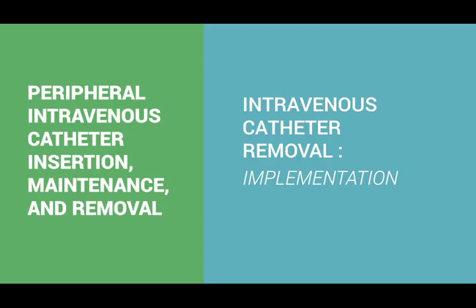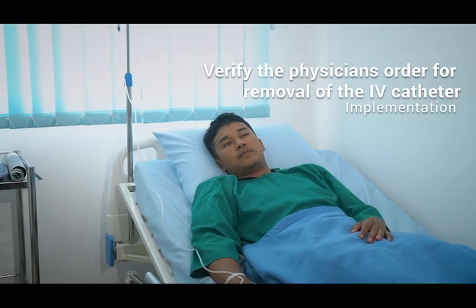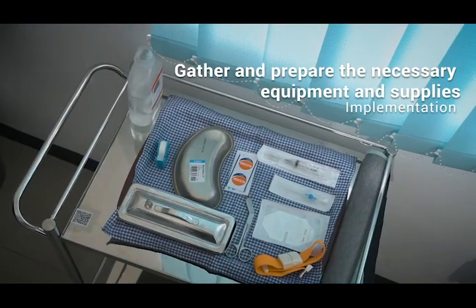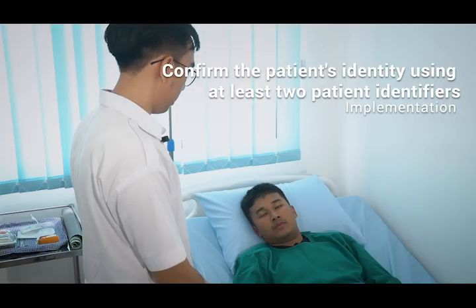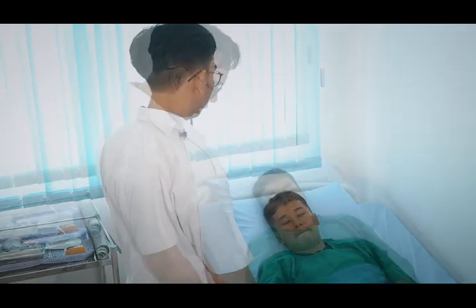Intravenous catheter removal. Implementation. Verify the physician's order for removal of the IV catheter. Gather and prepare the necessary equipment and supplies. Confirm the patient's identity using at least 2 patient identifiers. Could you please say your name and your date of birth?